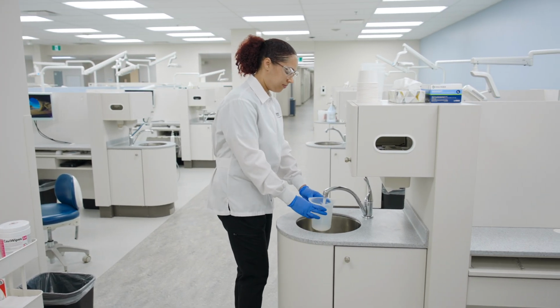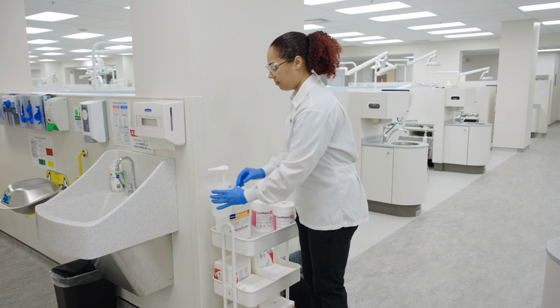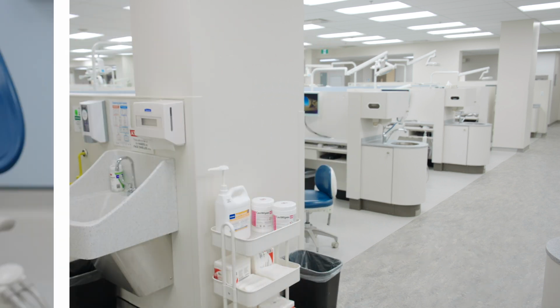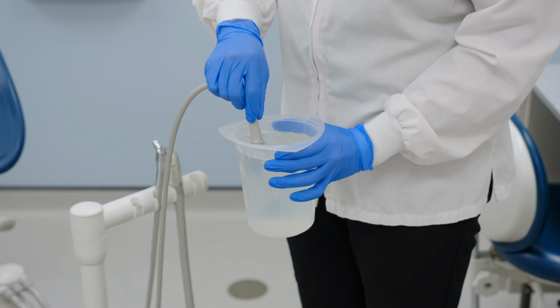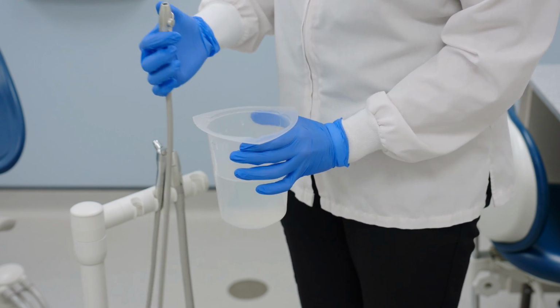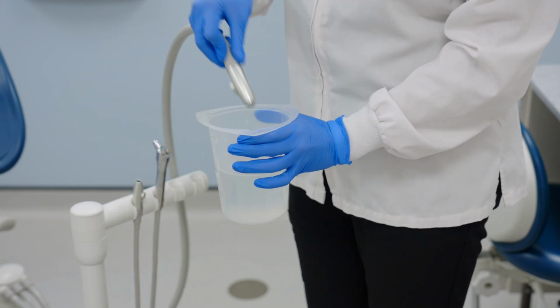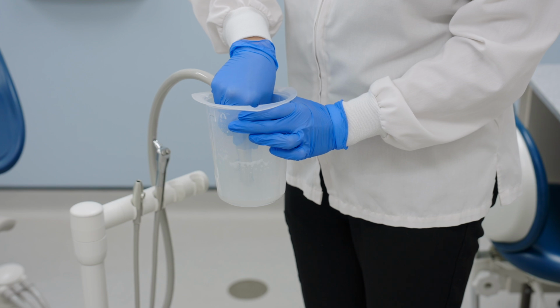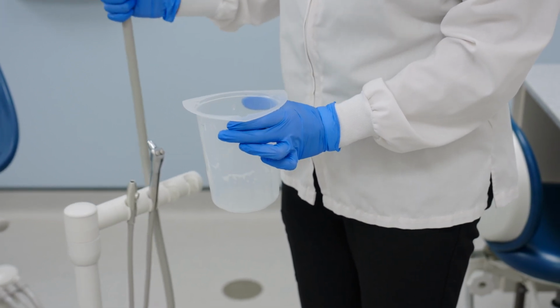Fill the clear plastic beaker to the 1,000 milliliter line and dispense 1 pump of Microvac or Nutravac into the water. Using this solution, start with the low volume suction and draw up half of the solution from the beaker. Return the suction line to the cradle and pick up the high volume suction line and draw up the remaining solution. This step is crucial as it removes biofilm that may have formed within the suction lines.